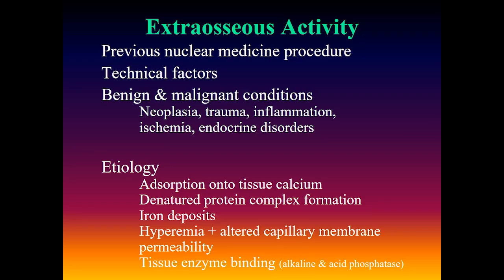It can be due to technical factors. It can also be seen in a variety of benign and malignant conditions, including neoplasms, trauma, inflammation, ischemia, and various endocrine disorders. The etiology is multifactorial, consists of adsorption of the radiopharmaceutical onto tissue calcium, the formation of denatured protein complexes, iron deposits, combination of hyperemia and altered capillary membrane permeability, and finally tissue enzyme binding.